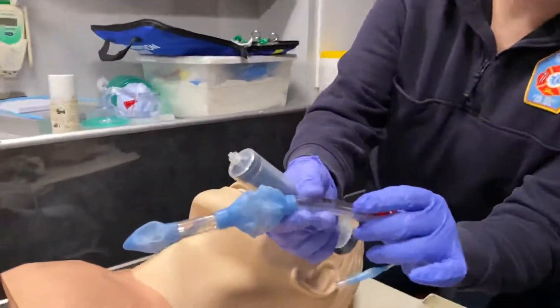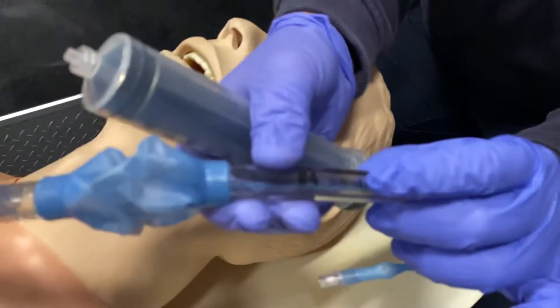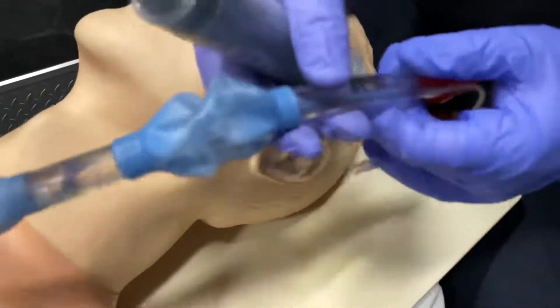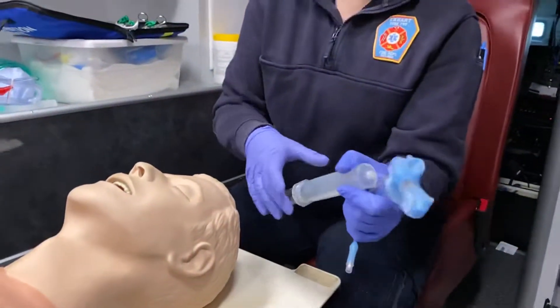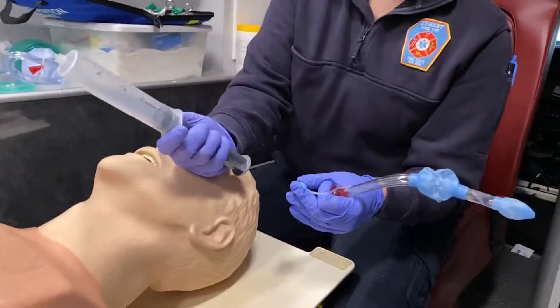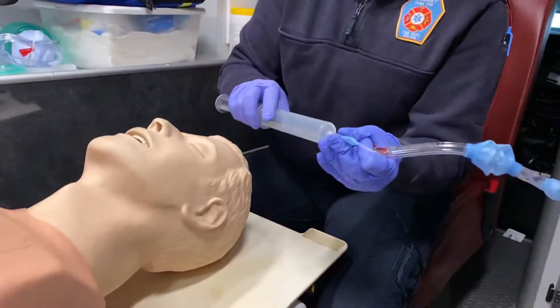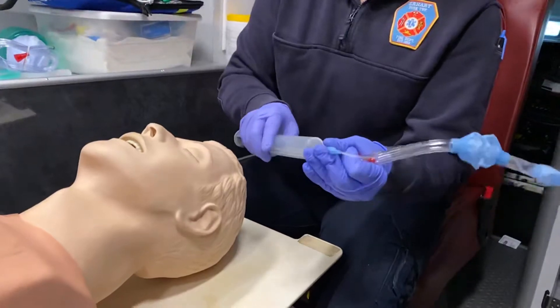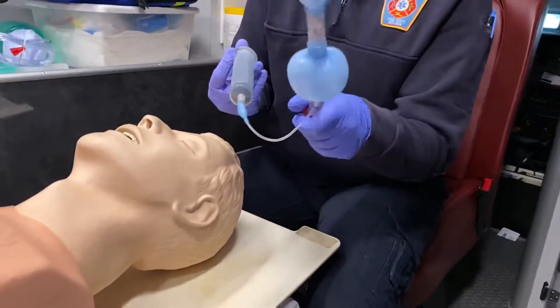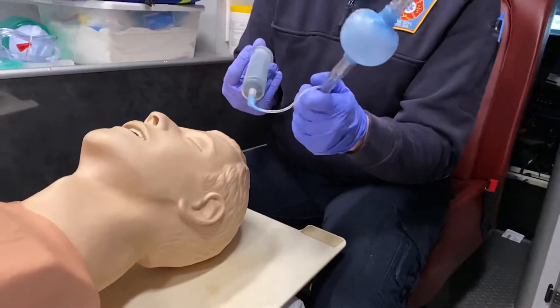The King Airway will tell you how many mLs to insert into the inflation balloon, so we do want to test that prior to inserting to make sure it works correctly. I'm going to draw 60 mLs of air into my syringe. This is a twist-on syringe, so I just press and twist slightly. I want to check my balloon to make sure there are no holes or leaks.